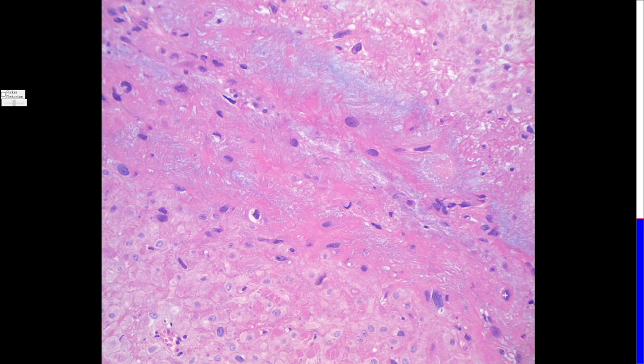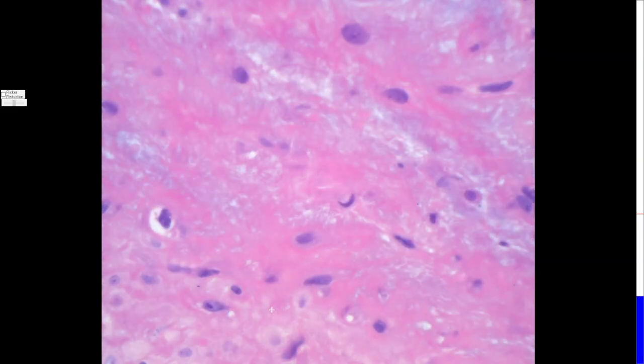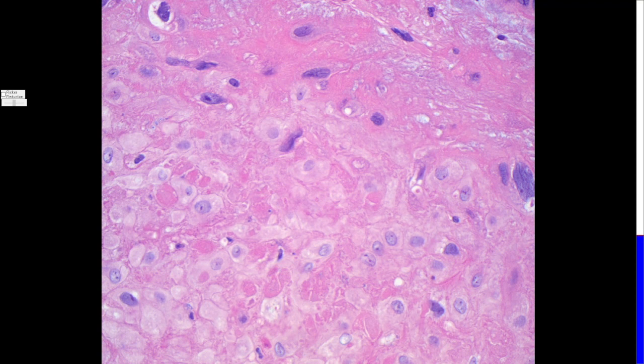All the atypical cells we're seeing with hyperchromatic irregular nuclei are extravillous trophoblasts, while these cells here at the bottom, or those at the top, right there, those are decidual cells. Decidual cells have much more regular nuclei, with open chromatin and a small conspicuous nucleolus. So all of those I'm pointing are decidual cells, while these big ugly guys here are all trophoblastic cells.